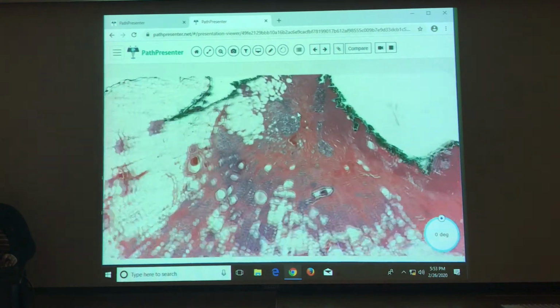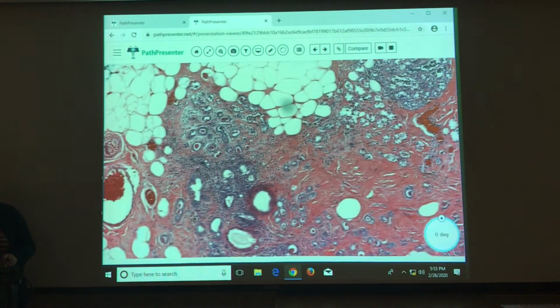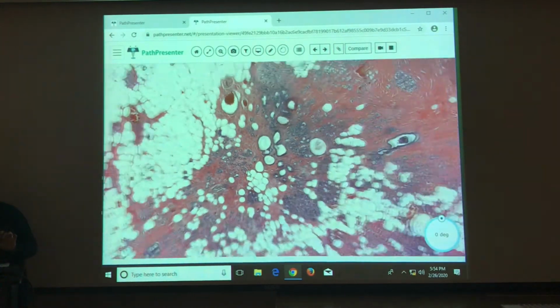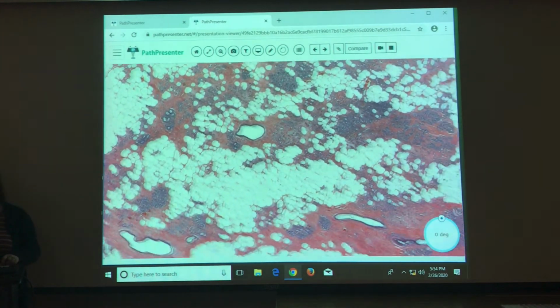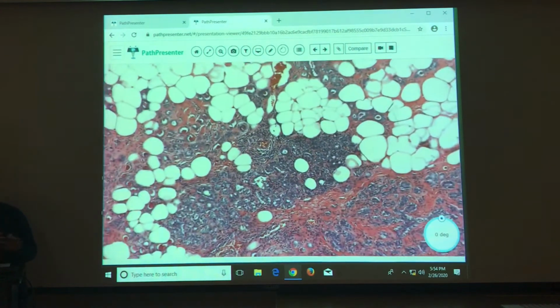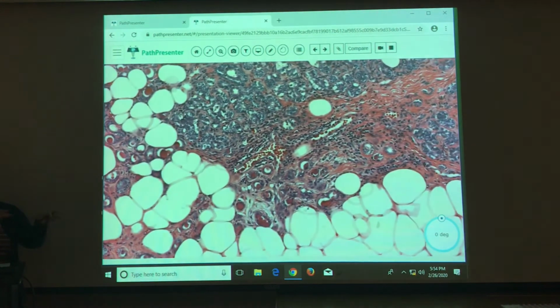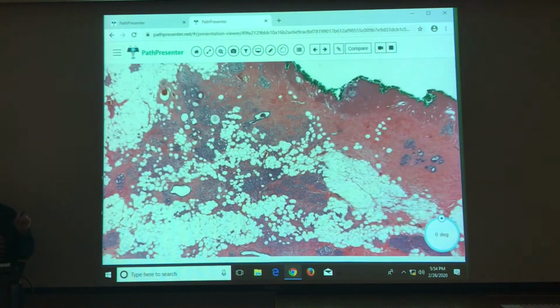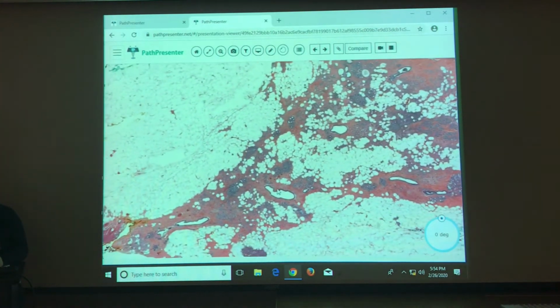The kind of neat thing about microglandular adenosis, though, is that no matter how it looks, you don't really get much stromal effect. There's no real desmoplasia. You're not really even going to see inflammation with it. It's just very bland, but it's there. It's just going to trickle through everything. But you honed in on the eosinophilic secretions, because that's one of the things that does help you.